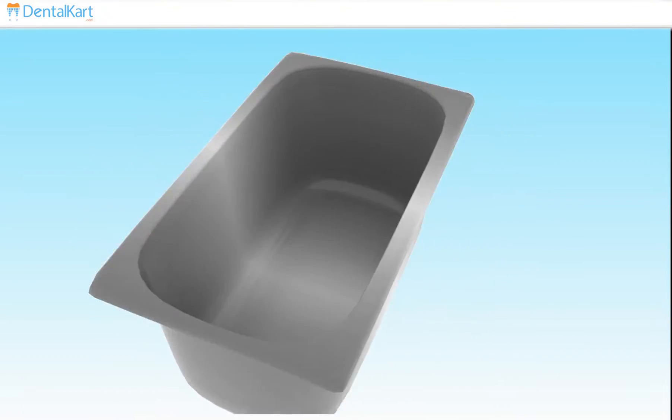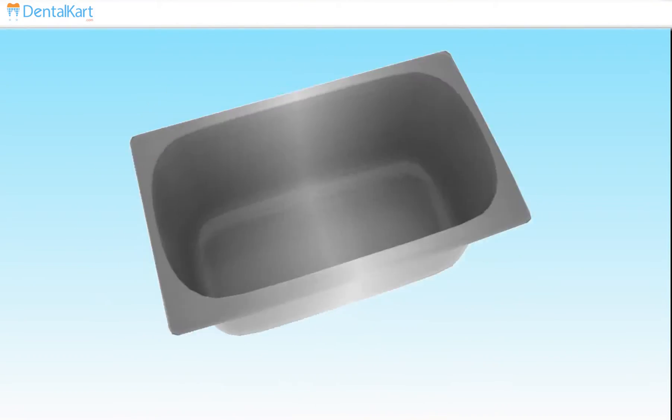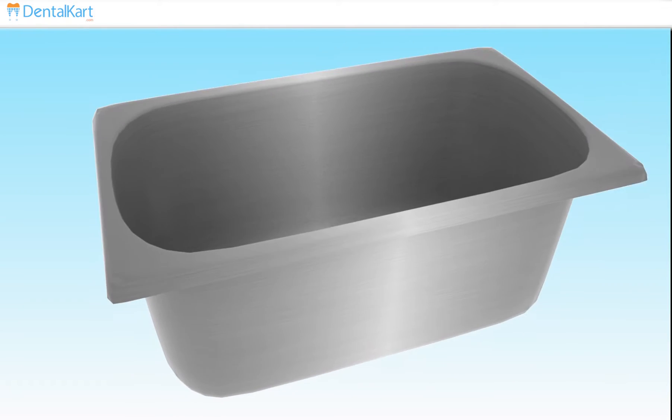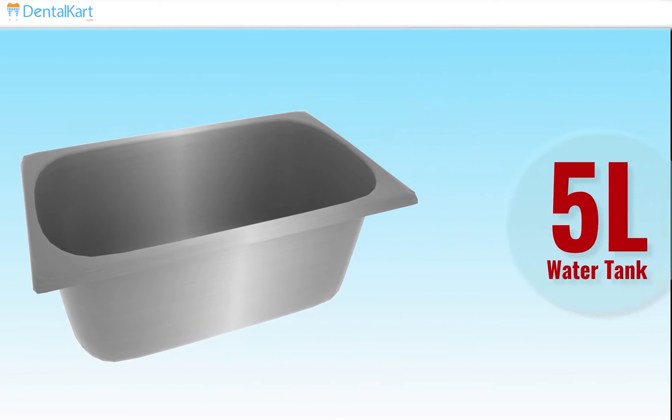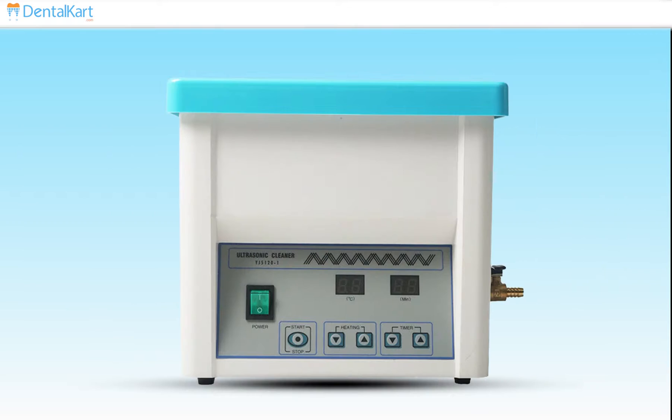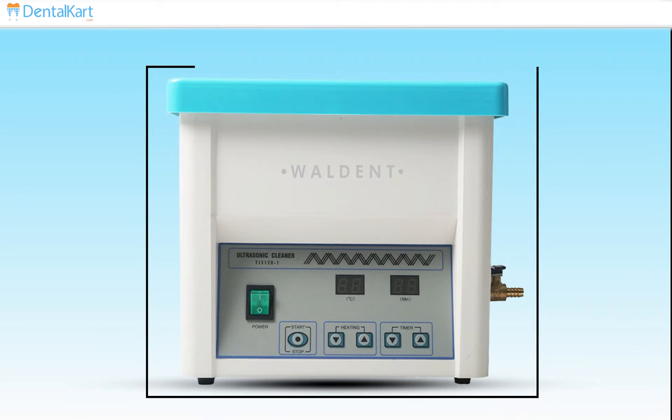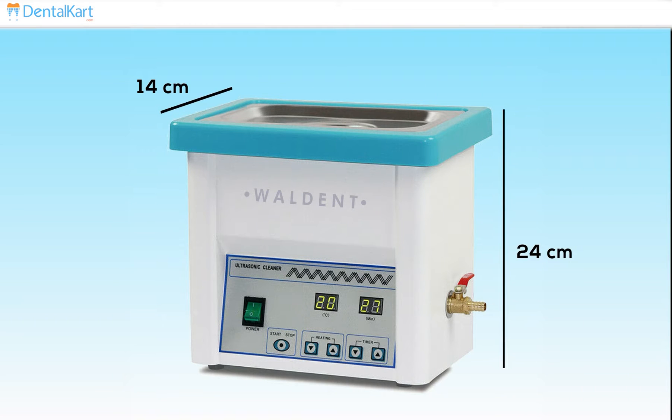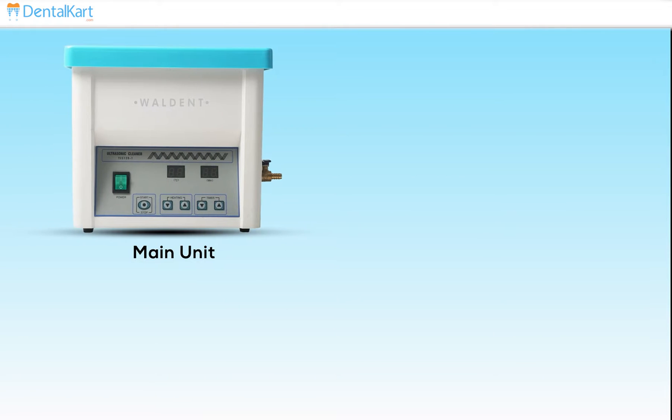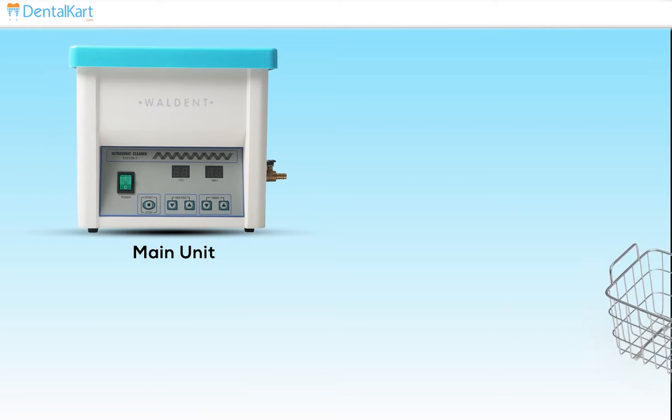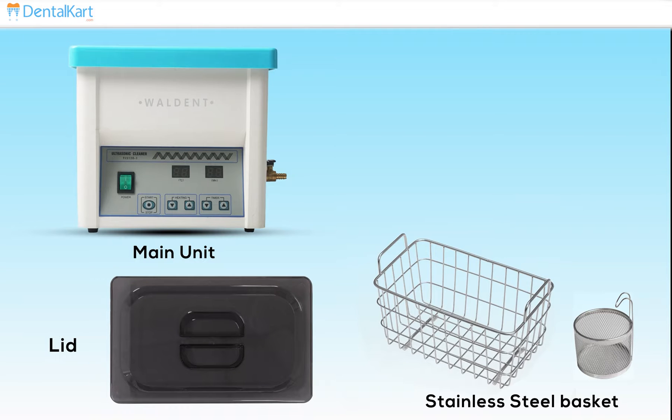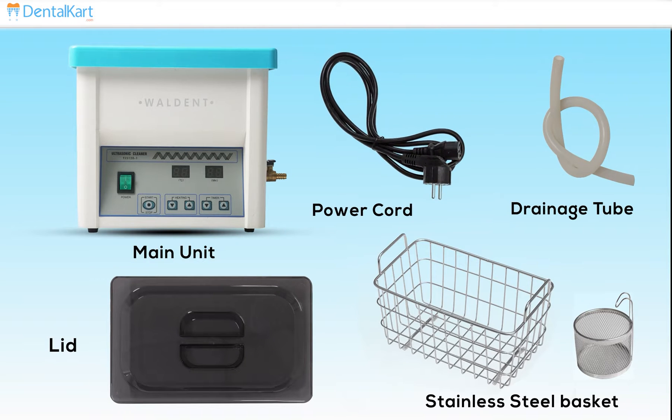Waldent Ultrasonic Cleaner is made with high-quality stainless steel with 5-liter tank capacity. It is designed as a cubicle-shaped box with 24 centimeter height, 14 centimeter length, and 15 centimeter width. It comes with the main unit, stainless steel basket, lid, drainage tube, and power cord.